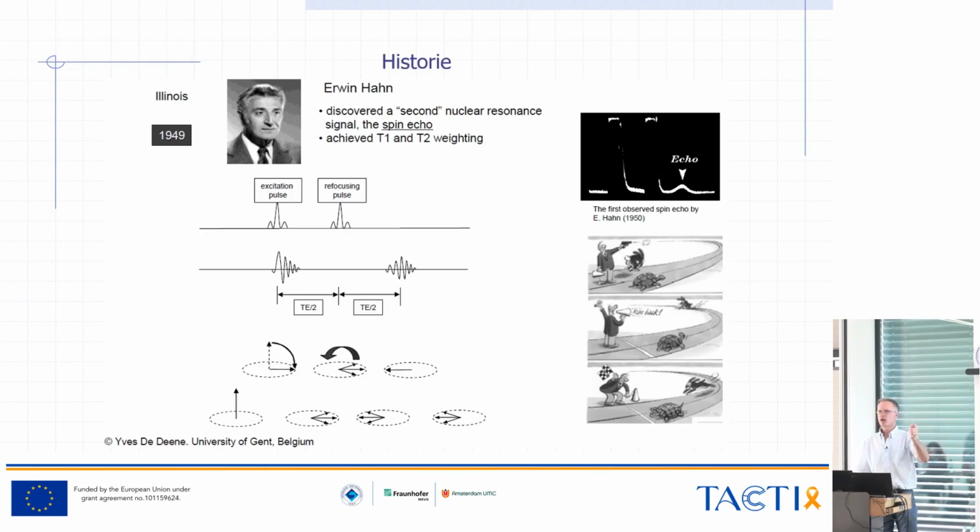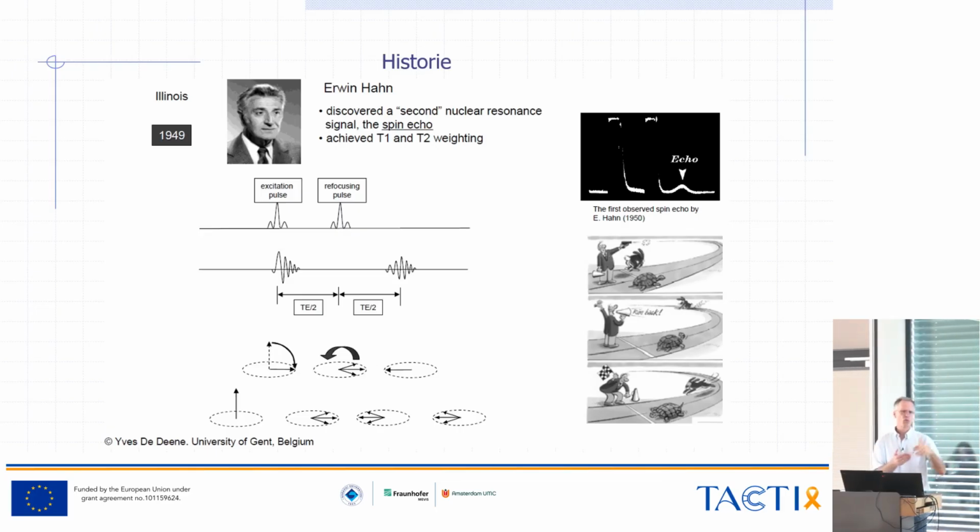You let them start, and then at a given time, you give another command and tell them, now return. Of course, the quick runner would be maybe halfway round, the other one maybe just 1 meter away. But when they turn around and run back, they will come back to the start at exactly the same time, because one is really fast but has to run a longer way, and the other one is slow but has to go only a shorter distance.